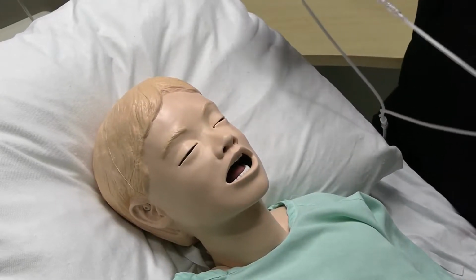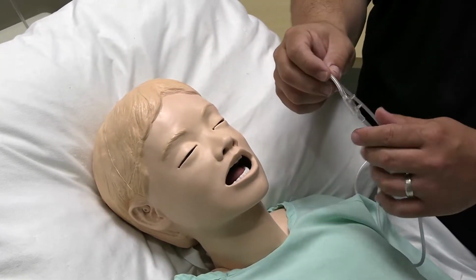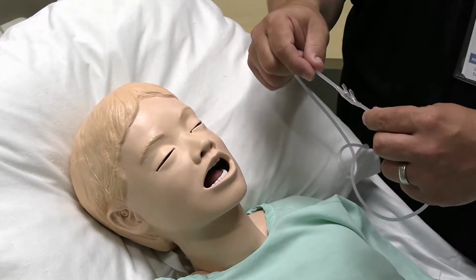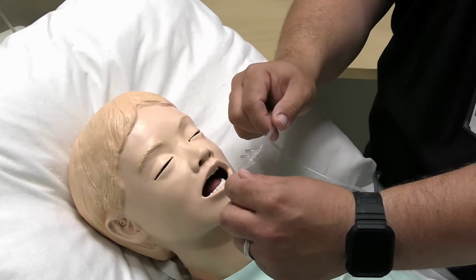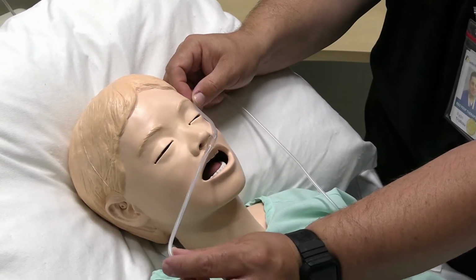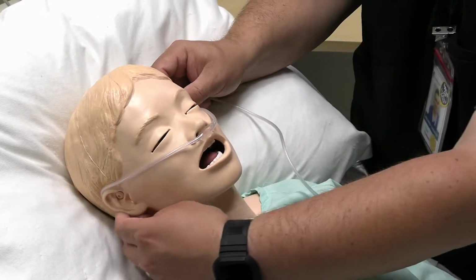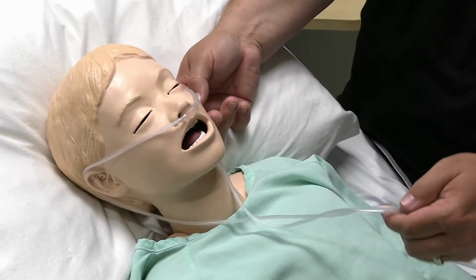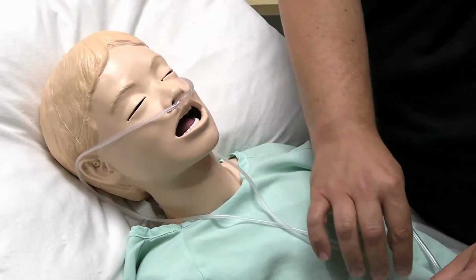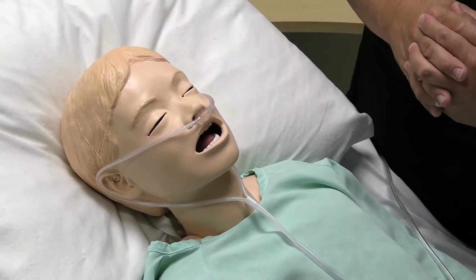Now we come over to our patient for application of the nasal prongs. When you're looking at your nasal prongs, there's a little bit of a natural curve to the prongs. I'm not sure if you can see that there. But you want to approach your patient with the natural curve to help insert the prongs into the nares. You then are going to wrap it around your patient's ears, just like so, and then you're just going to snug it up to the patient, just like so, so that it stays on comfortably for the patient.